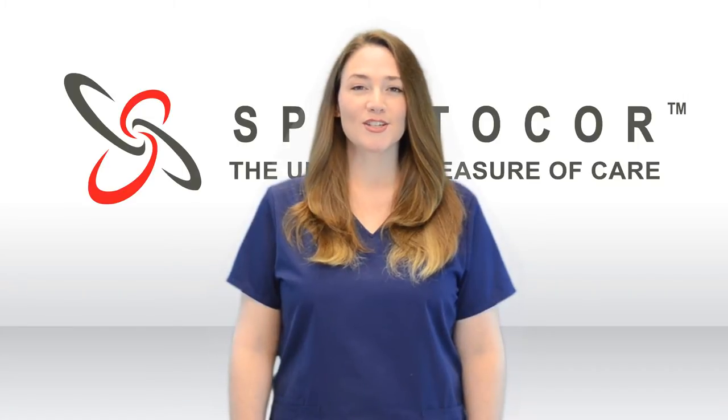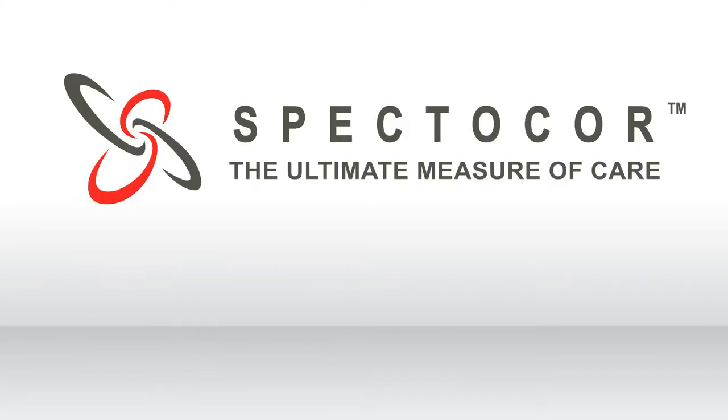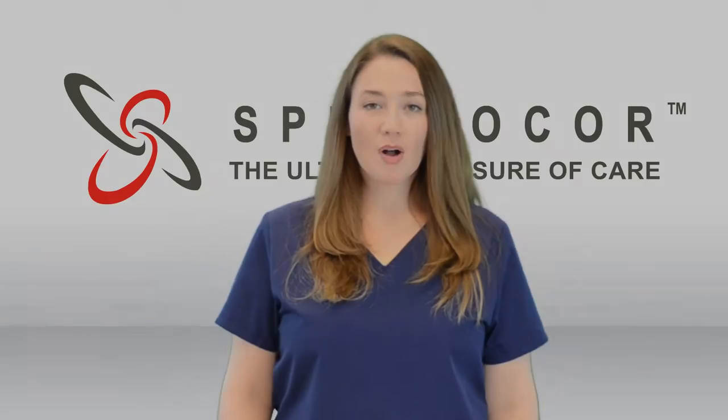Welcome to Spectocor, the ultimate measure of care. This is Yondi, and I'm going to show you how to set up your Pocket ECG.